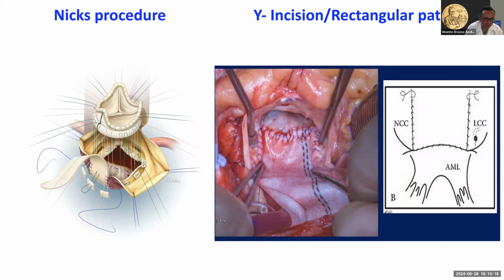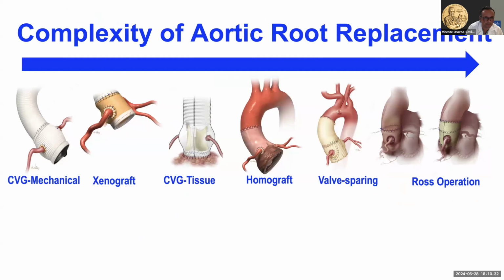So we put up our classic patch. We enlarge a valve by another size, so from 21 you should get a 23, and that would probably be good enough even for a TAVR platform in some patients with decent BMI.